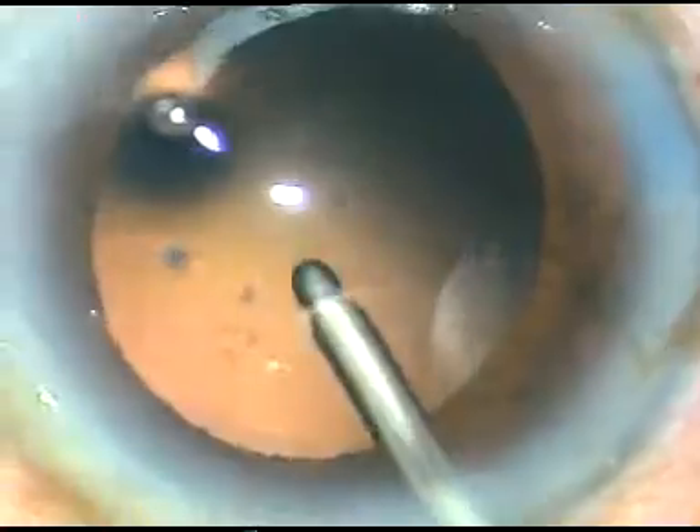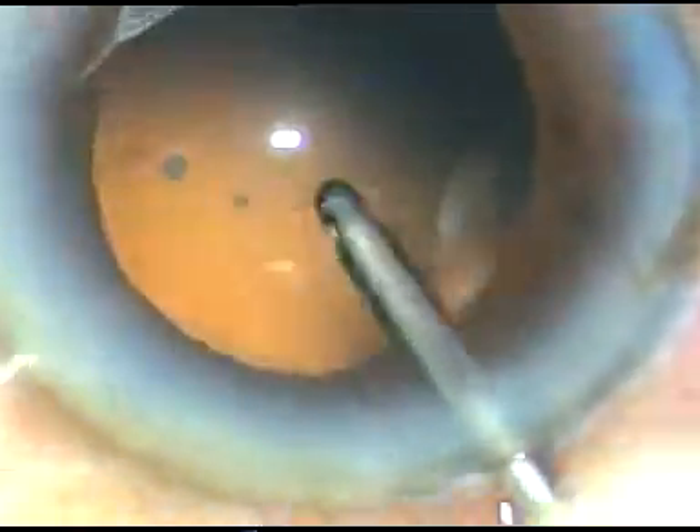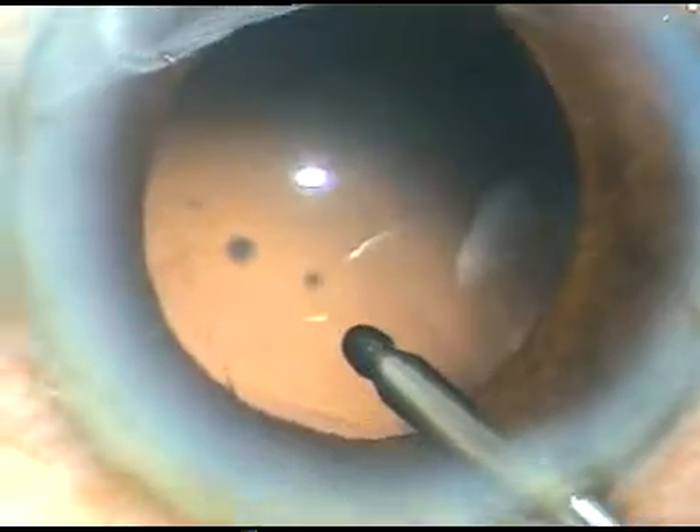In this case I am going to do hydropolish. The irrigating probe for bimanual IA is taken, and a jet of irrigating fluid is used to polish the posterior capsule. Most of the cells have been dislodged and the posterior capsule is becoming very transparent, clear of any cells.